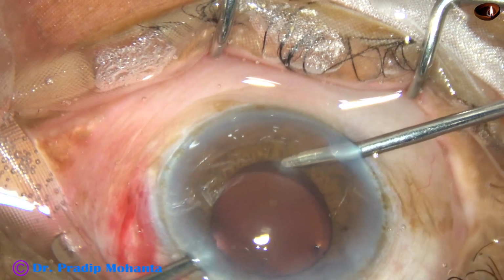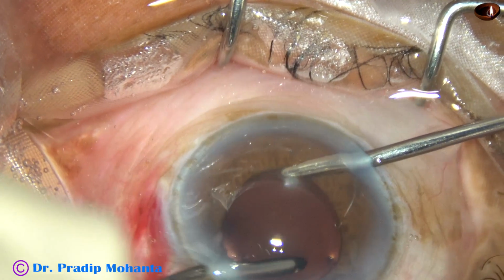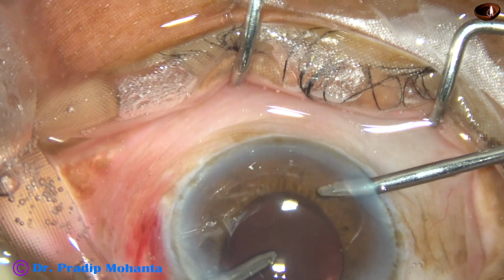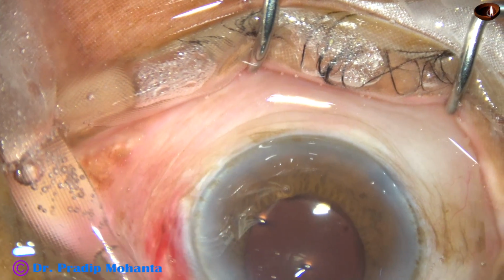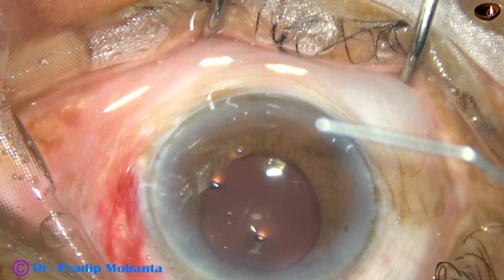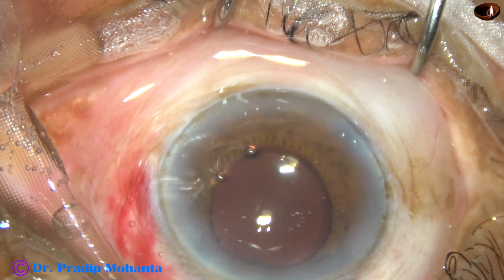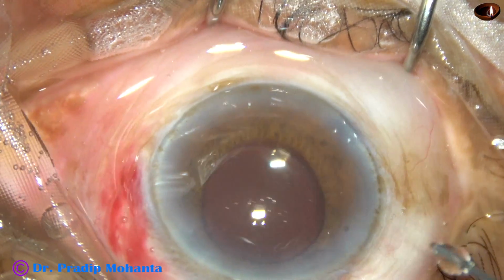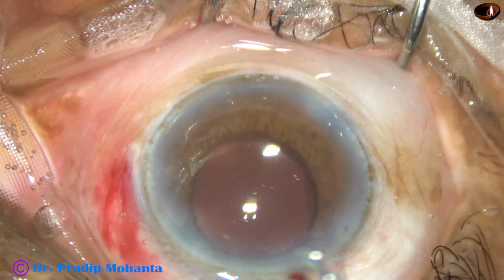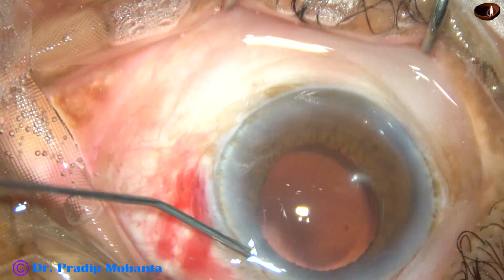Now I'm using irrigation and aspiration together. And a thorough cleaning of viscoelastic substance is done, because unless we do this, we are going to have raised intraocular pressure next day. Some visco is injected and the side ports are closed, hydrating corneal stroma on either side of these stab wounds.